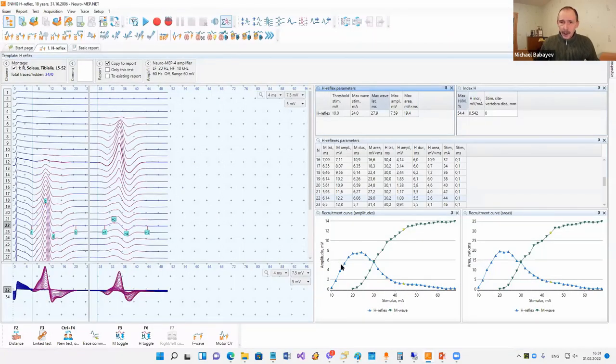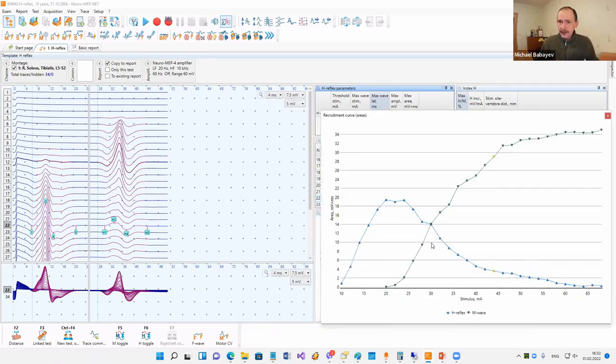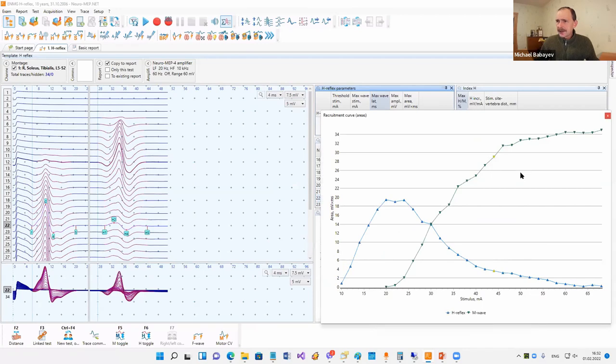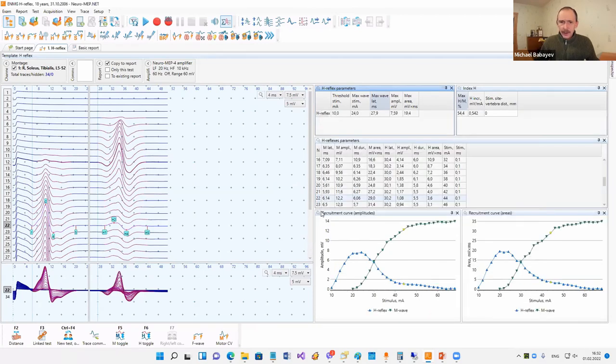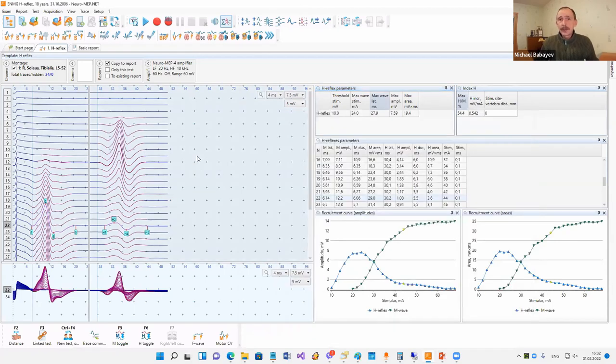Also, you can see such a button on graphs. I can press this button and the graph becomes bigger with more details. If I want to close it, I press Escape, click the cross, or click the mouse outside this window and it will close.